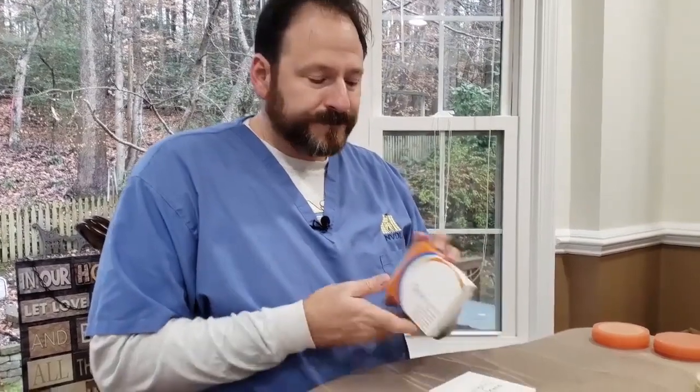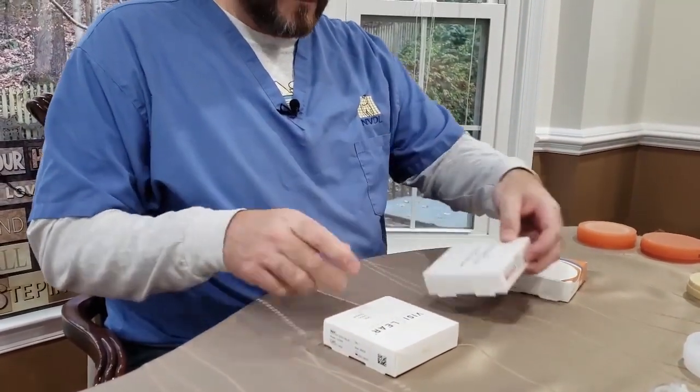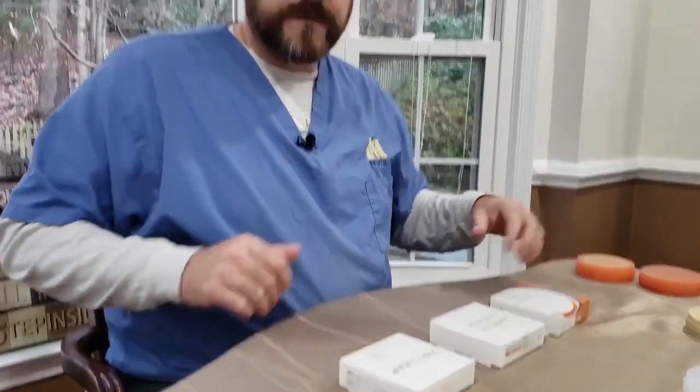Hey guys, this is Christian Warren. There's been some confusion as to when, where, and what to use with some of these new thermoplastic milling materials. The three I'm going to talk about today are the Xurlux Acetal, the DuraFlex, and the VisiClear pucks. These come in 15, 20, and 25 millimeters, so you can pretty much mill just about anything you'd want.